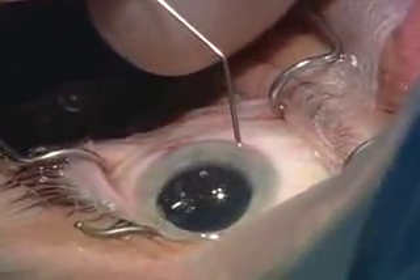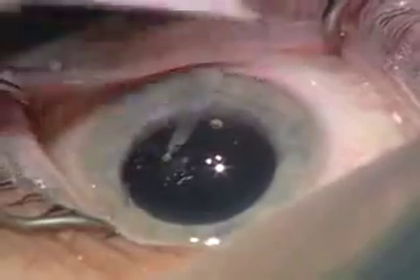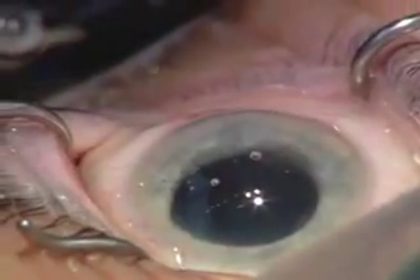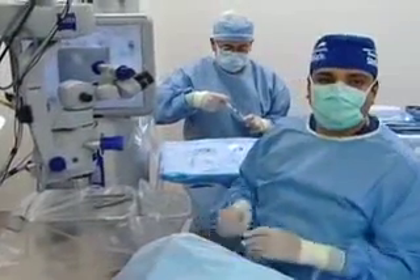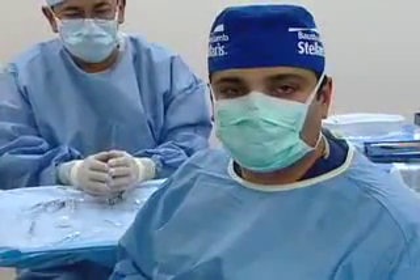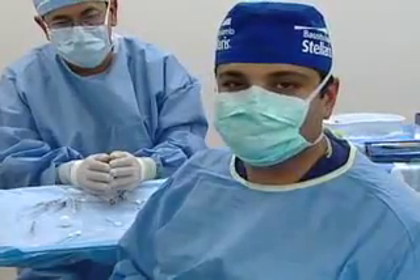Now we'll finish hydrating the incisions. I'll check our incisions — take that tetracaine on a Weck-Cel, just to make my patient happy. You can see how this lens truly is posteriorly vaulted in the eye. Everything looks gorgeous. Thank you for being part of this program — I truly enjoyed doing the live surgery. The only bad part is I've got to catch a red-eye to join you guys in the morning. Back to you Dick in Atlanta. Thank you. I think it's a new era — this is the new way of doing cataract surgery; it certainly is for me.